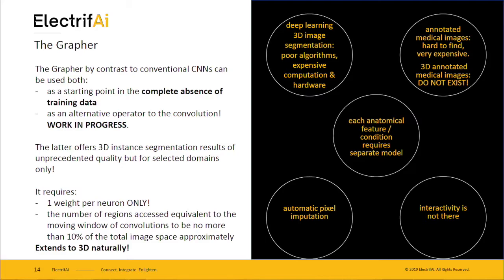And of course, if you stop with the 2D example, you already see how expensive it can be to do segmentations there, and sometimes the hardware in itself can be particularly demanding as well. We use GPUs extensively, but this is something that we try to make our technology invariant to. We want to make this a lightweight technology that can run pretty much anywhere.